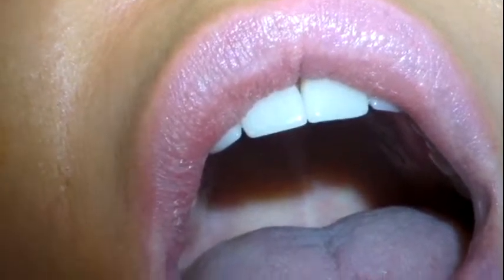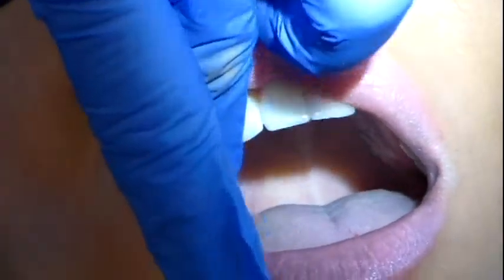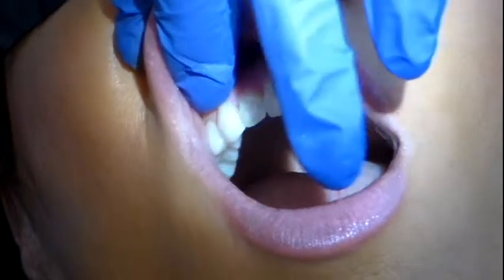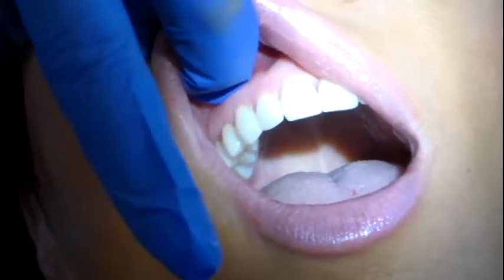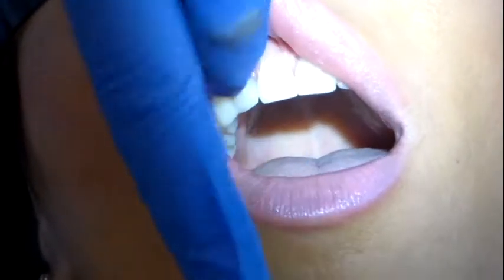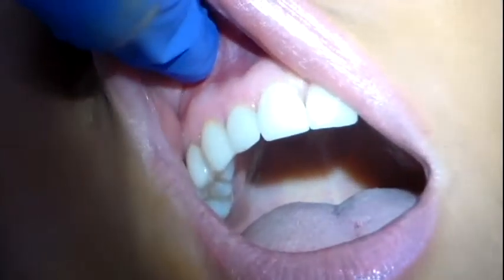Now, as I mentioned before, you have to match the slope of the alveolar bone, and sometimes it helps to have a fulcrum. Sometimes I retract the lip with my pointer finger and my thumb, and I use my middle finger for a fulcrum, and sometimes it works better the other way. I think on her it's going to work better this way. So again, when you retract, you need to be just above the site. Don't be back over here, don't be right in the middle, go right to the site and go straight out. And now my finger's ready to catch the barrel.